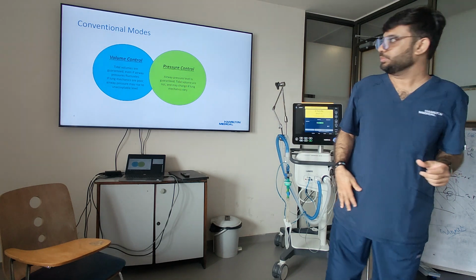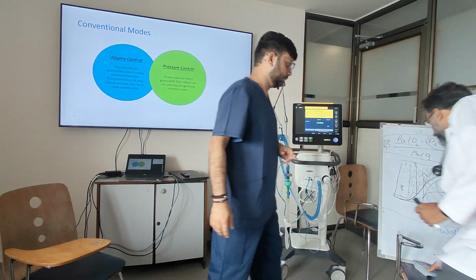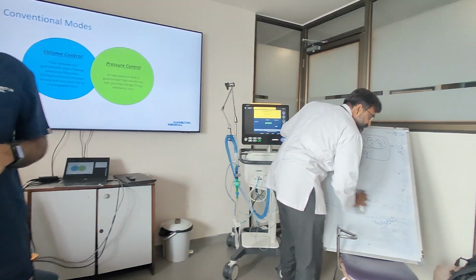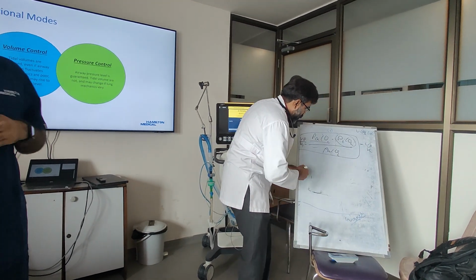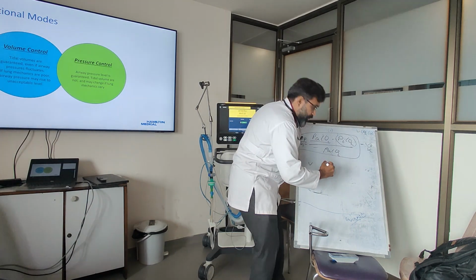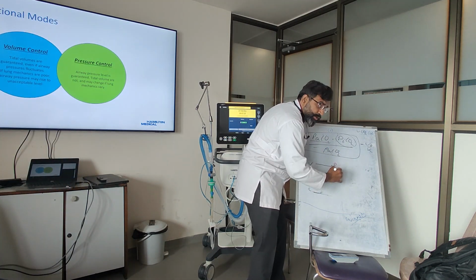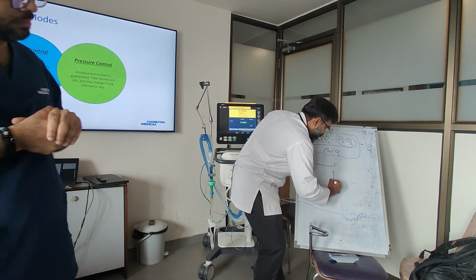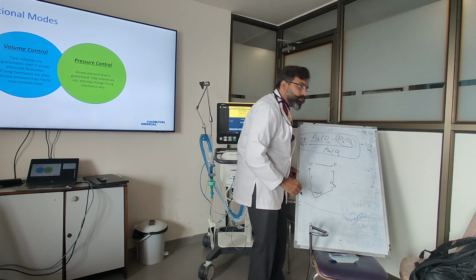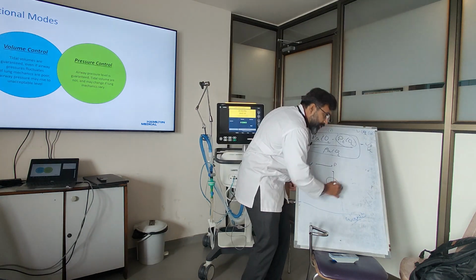The loop in such modes, it's got a loop. It's a physician-based closed loop. You understand? So, for example, I set a volume. If I set a volume, the volume shows a pressure differential. The physician completes this by looking at it, and then the physician comes in and changes the volume because the pressures are high. So this is a closed loop system with a physician in the middle.